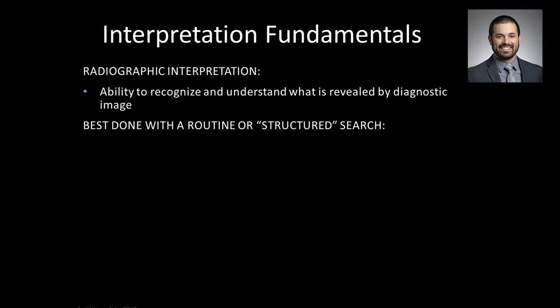That is best done with a routine, or I will say structured, search. What I mean by that is you have a set way that you review every single cone beam CT or PAN or full mouth series, and you do it that same way every time. Before I get to my additional points, I'll explain my cone beam CT approach. I open it up and start with the MPR view, and I scroll top to bottom several times, reviewing categories of anatomy: airways, bony contours, teeth, soft tissue, up and down.